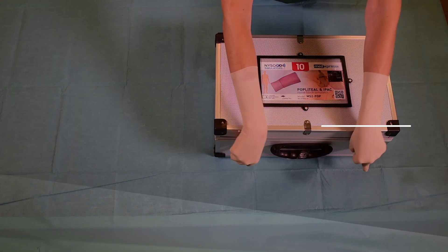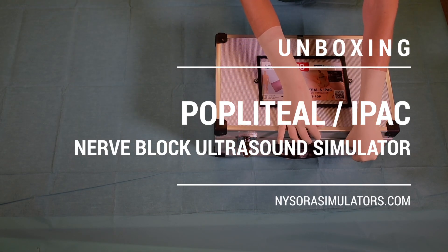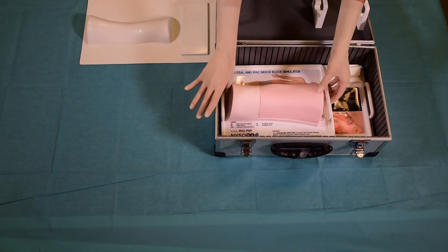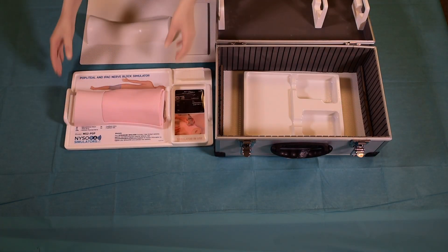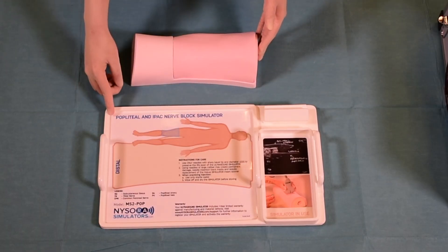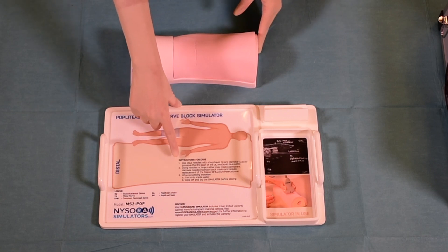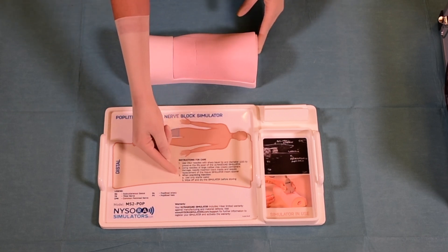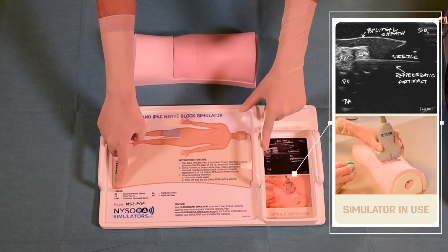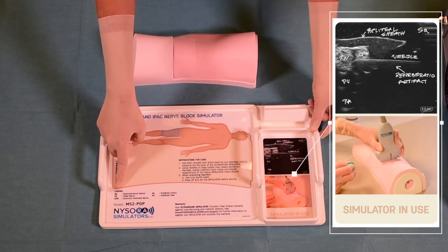Like all other Nysora simulators, the Popliteal and IPAC block simulator comes in a custom design box, which is convenient for carrying and storage. On the custom tray, there are clear labels as to which part of the body the simulator belongs to. Clear instructions for use are also provided, and all anatomical landmarks and abbreviations featured are printed on the label that accompanies the tray.